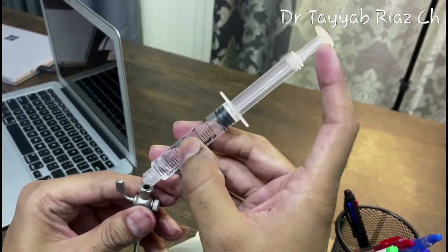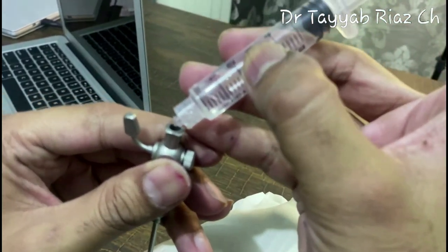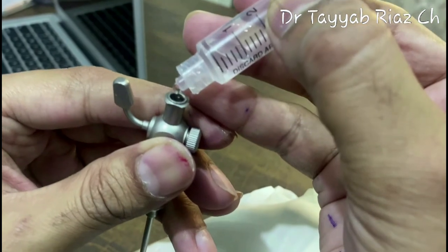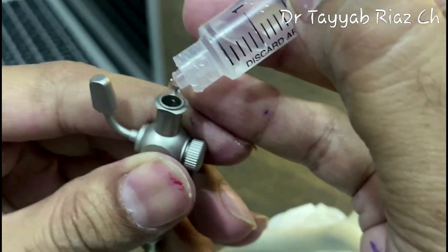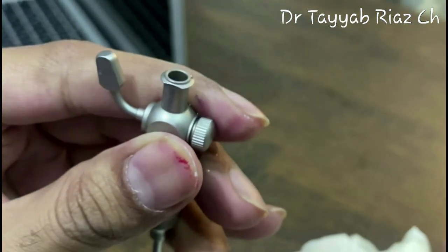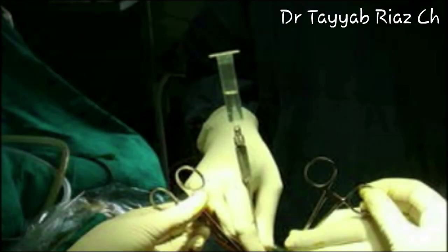And now performing the hanging drop test. When you put 2 to 3 drops over the opening of the stilet, they will get sucked in due to the negative intra-abdominal pressure. There will not be any drop hanging over the opening of the stilet. In the plunger test, if you remove the plunger and put saline in the empty syringe, it will get sucked into the peritoneal cavity under the effect of gravity.